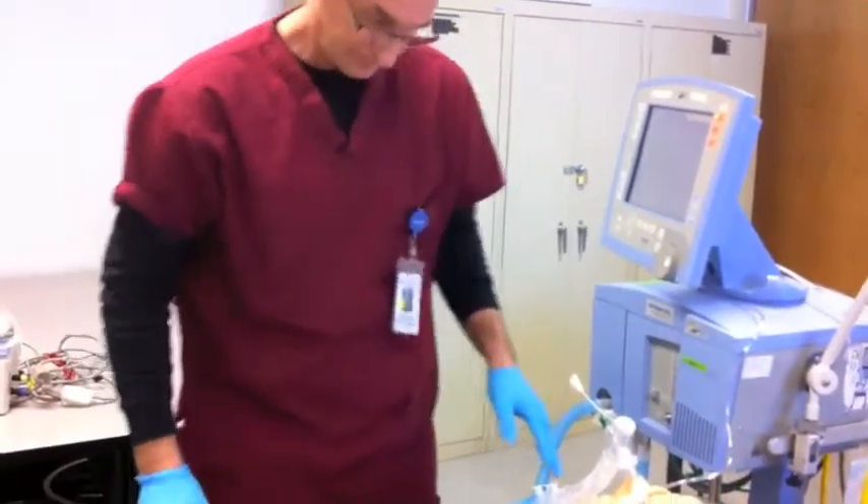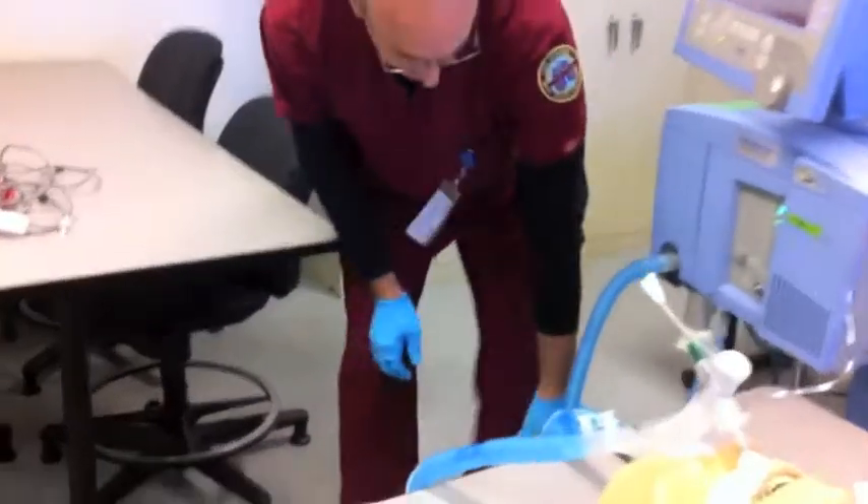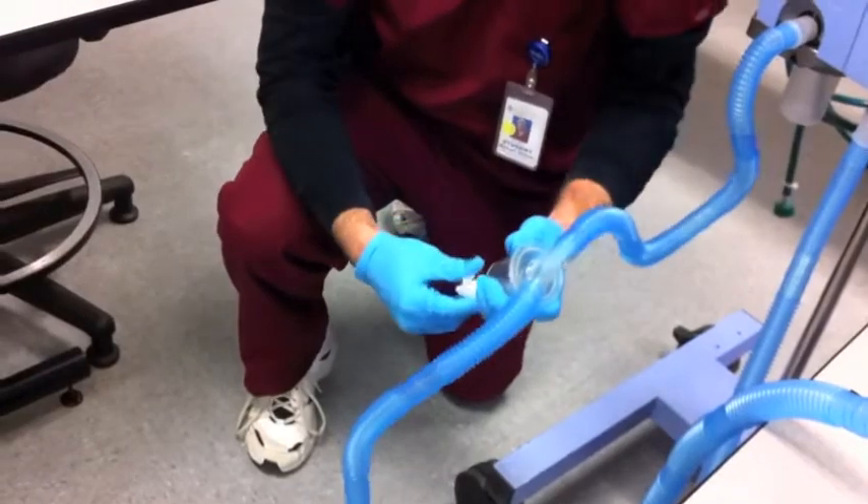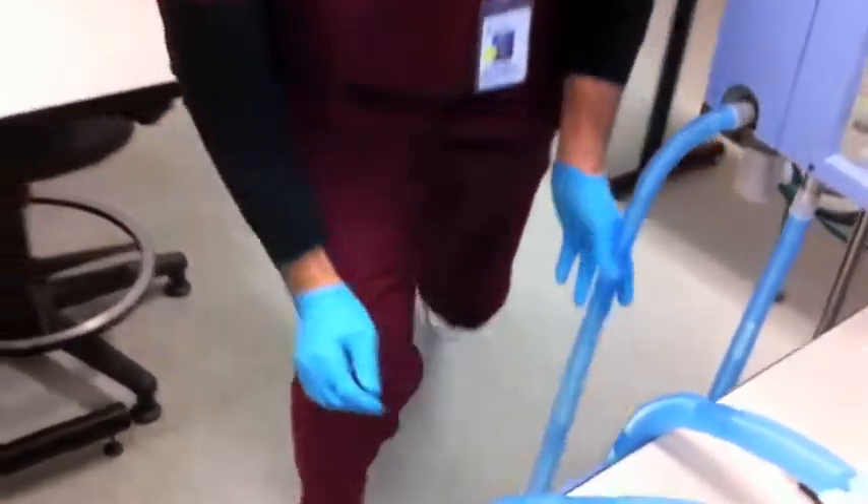Next, he's going to empty the condensate. He's going to check the tubing — we have two water traps here. Pull it out and drain it on both sides.